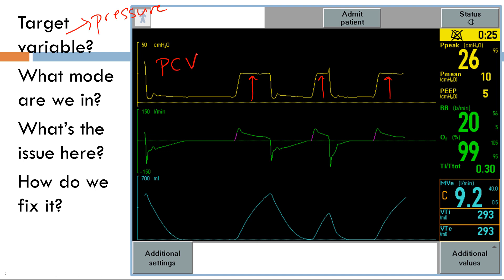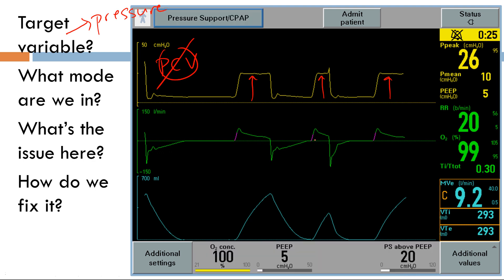This is actually pressure support ventilation, confirmed by the fact that there is no set respiratory rate — all breaths triggered are dependent on the patient. Reading each scalar left to right, there's no issue in the first breath, but then you see a positive deflection — this is dyssynchrony. It's towards the end of the phase, making it a cycle dyssynchrony. Since a positive notch deflection in the pressure scalar means the patient is expiring, and the patient is already expiring while the ventilator is still giving a breath, this is delayed cycling.